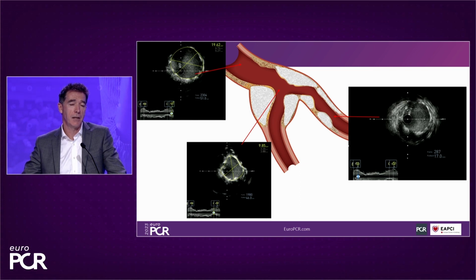So without this technology in this situation, we're taking the patient off the table to have a discussion with the cardiac surgeons, or talking about coming back for an LV-assisted all-in strategy to try and get equipment into the circumflex, rotablate it, and we've talked about the risks associated with that.